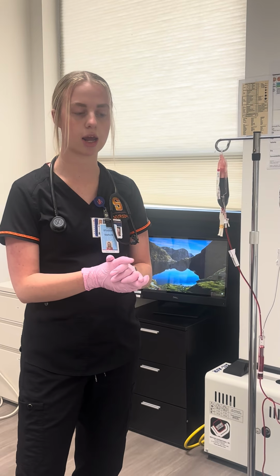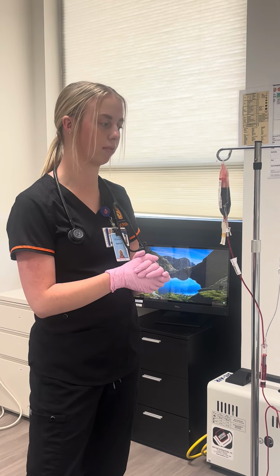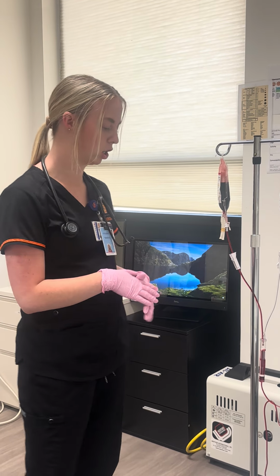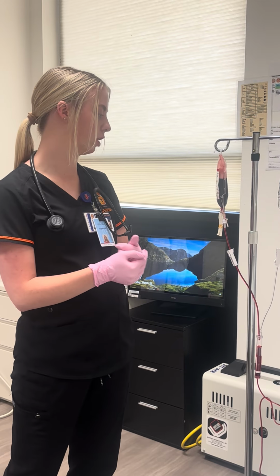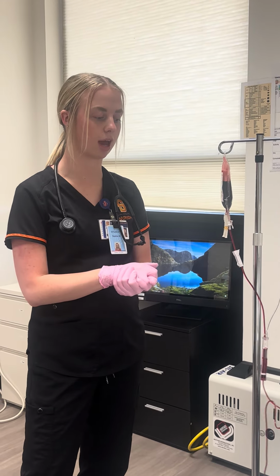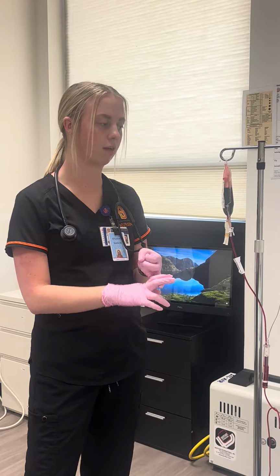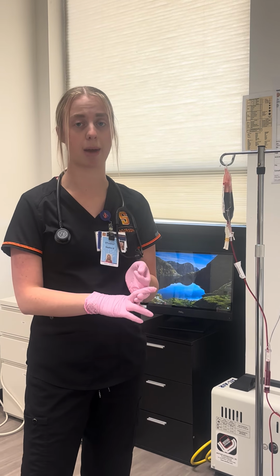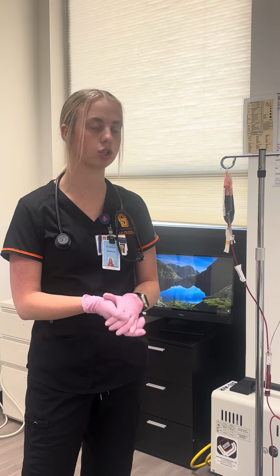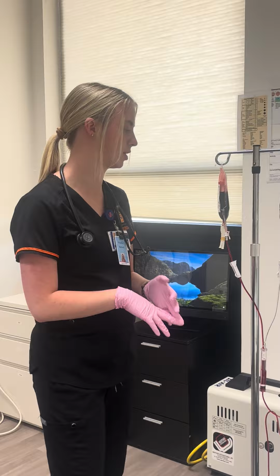So after the 15 minutes, if my patient looks all good, we're going to run the transfusion at a faster rate until the time is out. And like I said, within that 4-hour mark, we'll always be watching the line, make sure everything looks good. After we're done, I would check vitals again. I would also check them within an hour of running it. At the end of it, I would check vitals, and I would come back after an hour of a stopped transfusion and recheck those vitals and those fluid signs like the lungs and the vein distension.